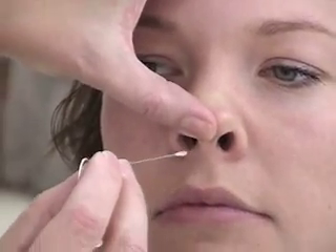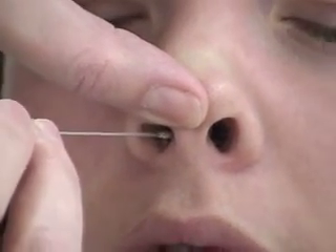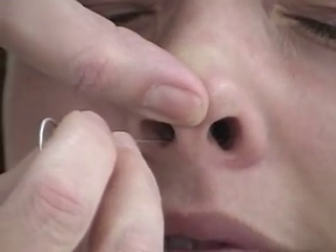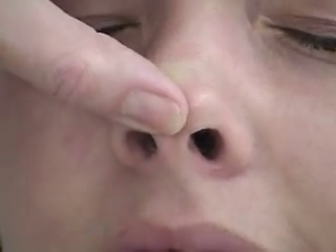Remember that the nasal passages go straight back. You want to lift the tip of the nose, put the sample in parallel, going a few centimeters above the bottom of the opening and going straight back about an inch and a half. Then you're going to twirl the sample slowly and leave it in for a total of about 15 to 30 seconds, and then bring it out.